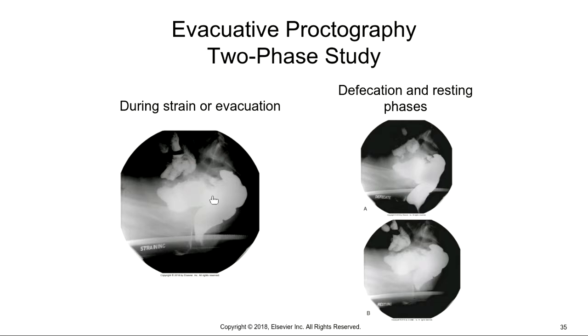So bearing down like they're going to have a bowel movement, actually having the bowel movement come out, and then the rest phase after the fact. So this is barium. This is not fecal material, but the radiologist takes images during these.